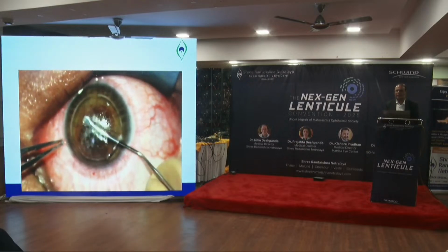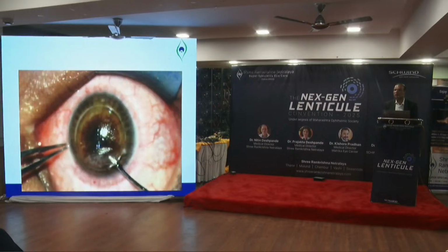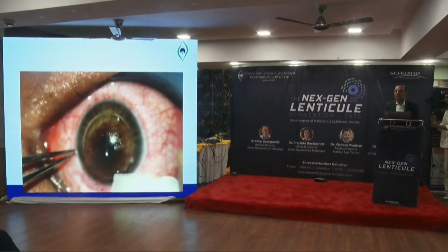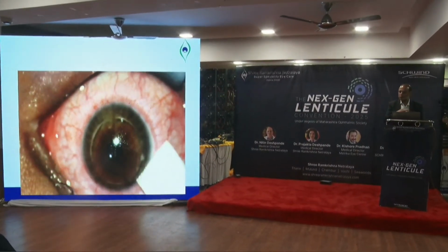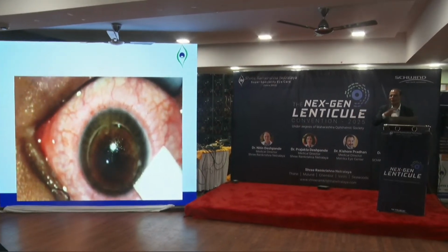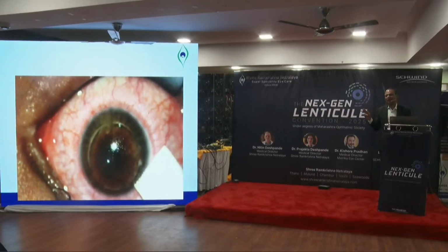And now you see that the lenticle is folding. So now I can take it out very easily. See, it's all come out, so you don't have to do too much instrumentation. Now it is very important that you get used to this smooth process, because every additional swipe is going to add a day to your patient's recovery, so you have to be smooth here. And so don't fiddle too much, putting forceps too many times. Everything is going to delay recovery. So the faster you are, the better your patient will look the next day.